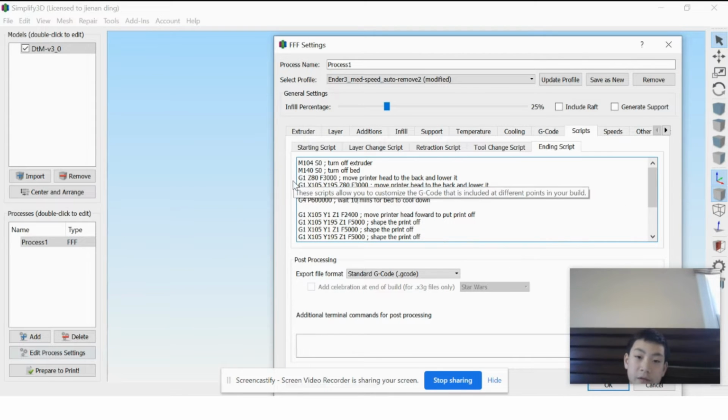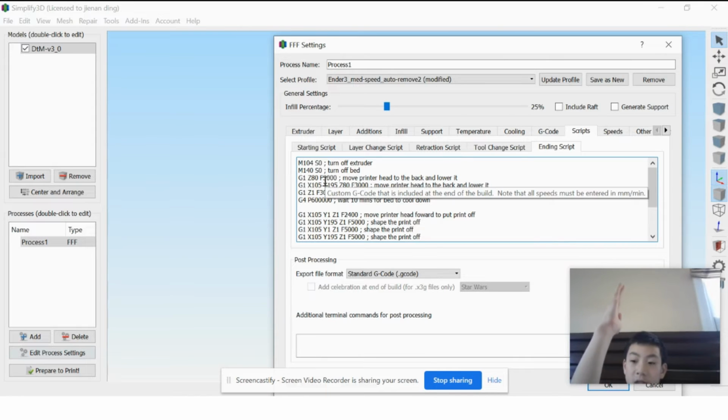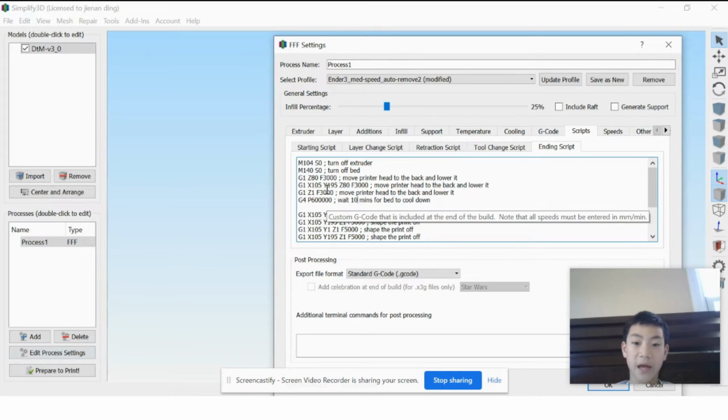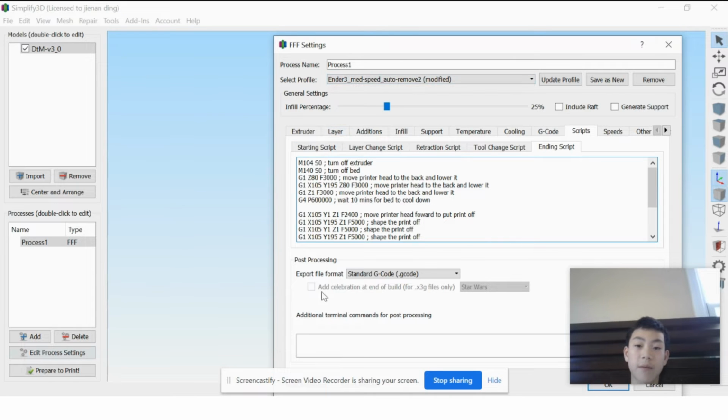Now, you might be wondering what these random numbers and words mean. The front, it just means the custom G-code at the end of the regular thing. Next, you can control the axes with the letters. Z is the up axis, Y is the forward axis, and X is the cross axis. Z positive would mean moving up, negative would mean moving down. X positive would mean moving to the right, negative would mean moving to the left. Y positive would mean moving forward, negative would be moving back.